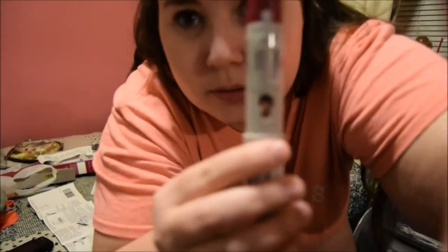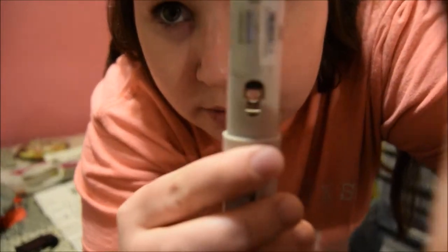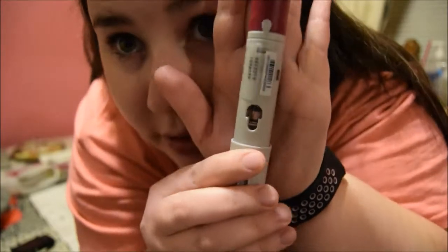Actually, I'll show you. See that line in there? I don't know if you guys will be able to see it really, but there's a line in there. Make sure it's there. Make sure it's not cloudy. It's not anything like that. It's got to be clear liquid. It's got to be filled at least to the line or above.